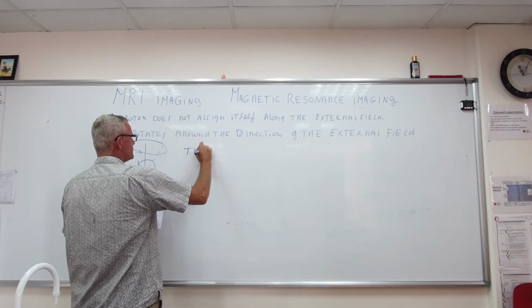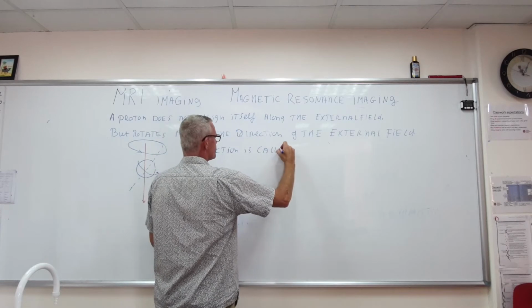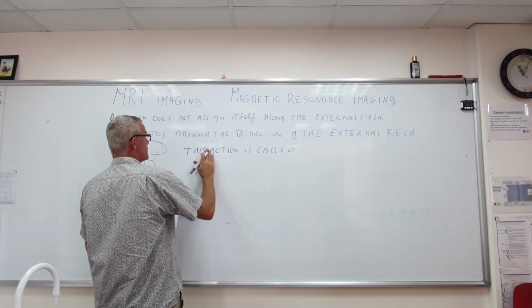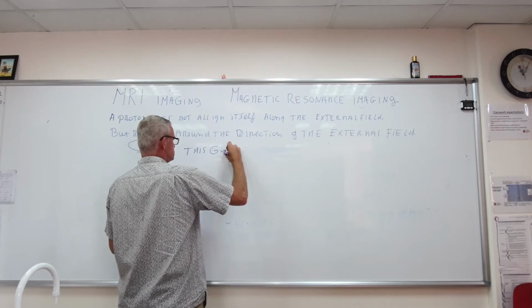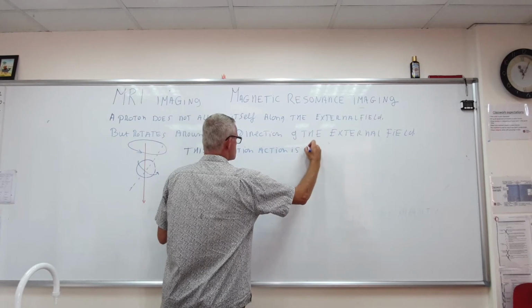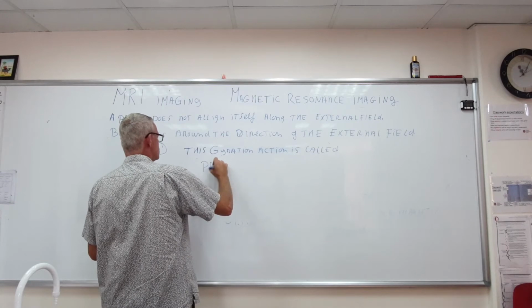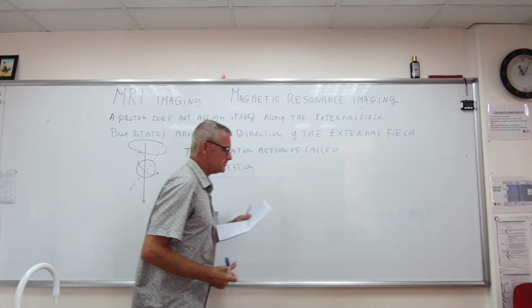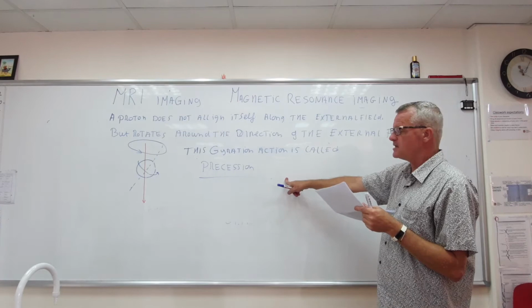So this action is called precession. Yeah, you need to know the word and you need to explain what we mean by precession.